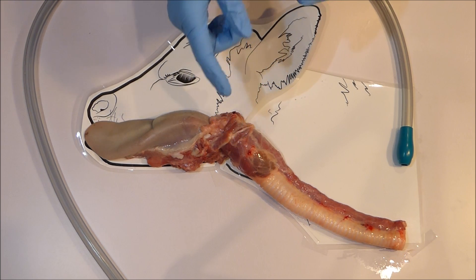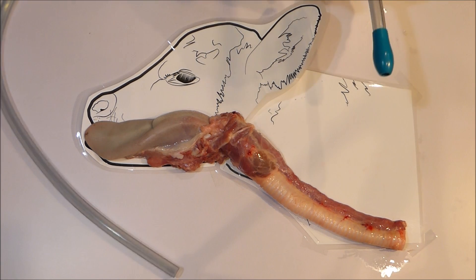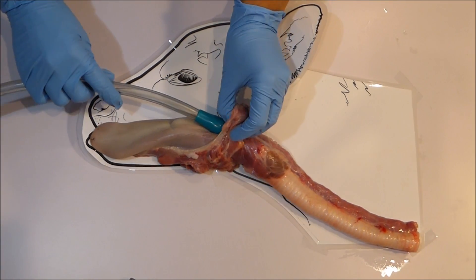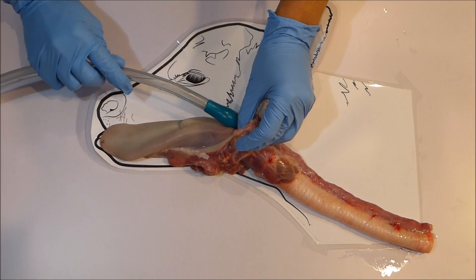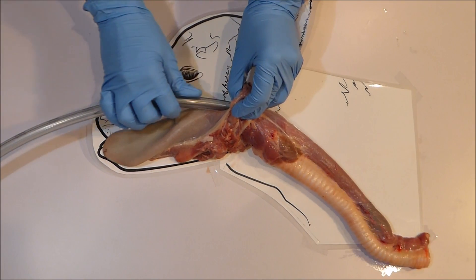Fortunately there is an excellent system designed here so that in a conscious animal it is far easier for solid items to pass into the esophagus than into the airway. So passing a tube into the airway is very easily avoided provided you work with your calf's natural reflexes.